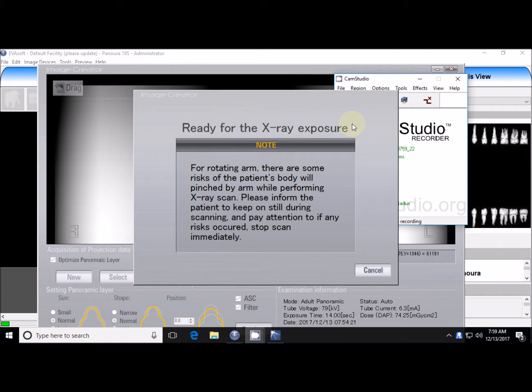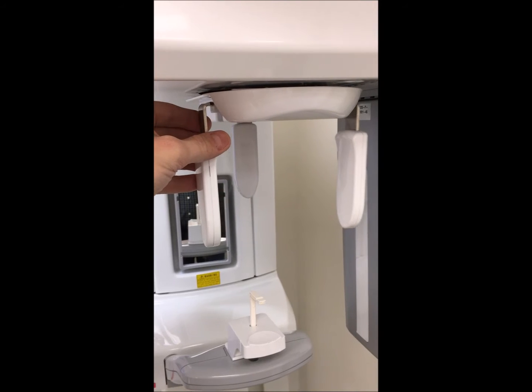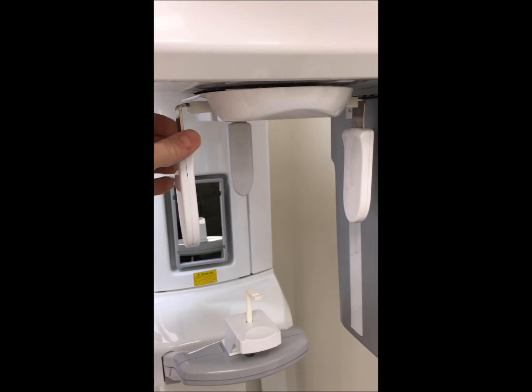Now that the Panora is ready to scan, bring the patient over to the machine. You can move the headrest to an approximate position of the patient's height by pressing the up-down switch on the console on the column. Next, have the patient remove their jewelry and eyeglasses. Before having the patient enter the machine, expand the headrest by pulling on one side.